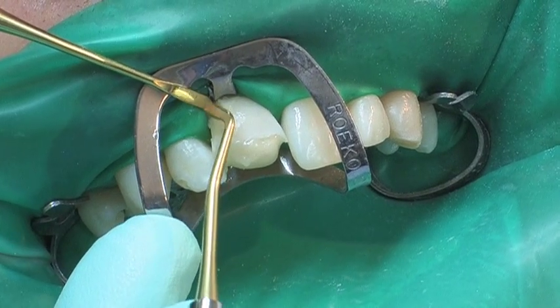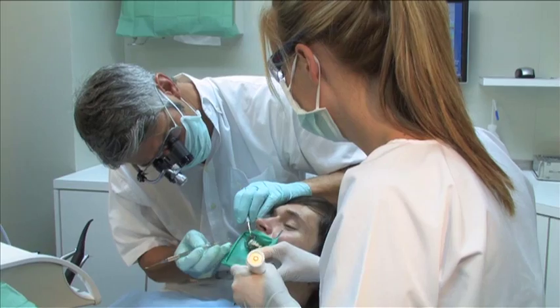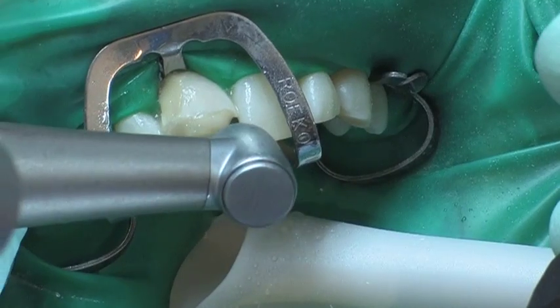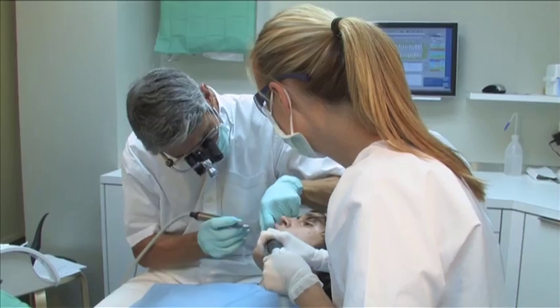A small increment of composite is applied, sculpted, and polymerized. The bulk crown preparation is performed using a 125 micrometer diamond instrument.